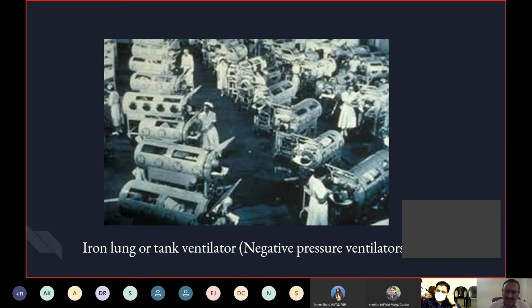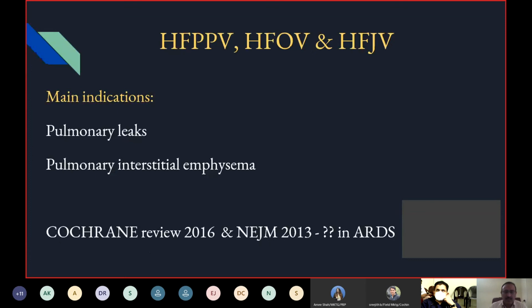And in the day, she was using some non-invasive methods of ventilation. So yes, till recently, this has been in use. It's otherwise called the iron lung. For quiz purposes, it is called the iron lung or tank ventilator or Drinker's ventilator, things like that.